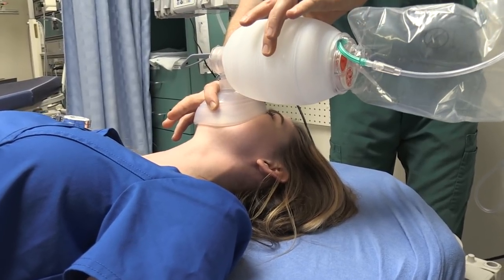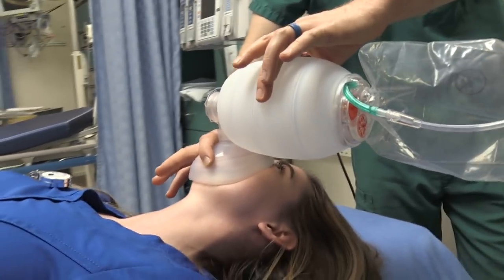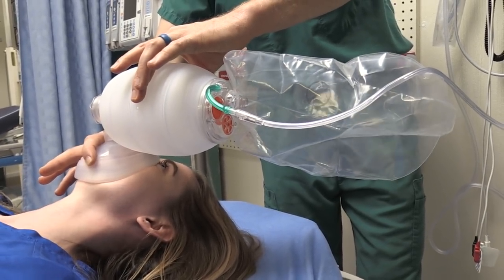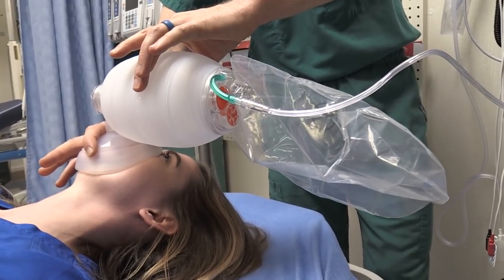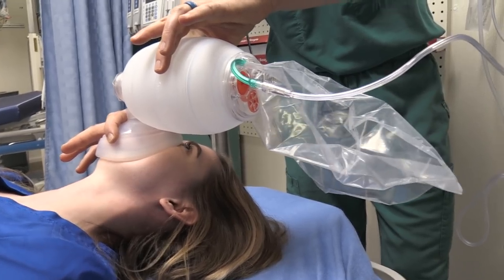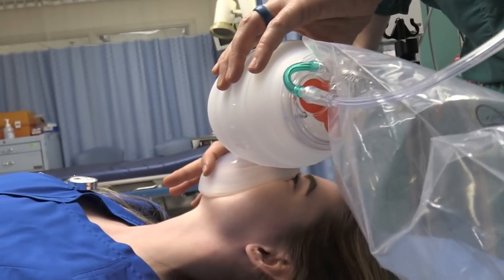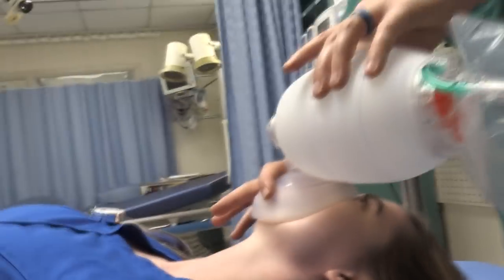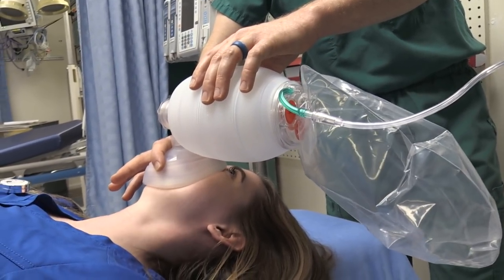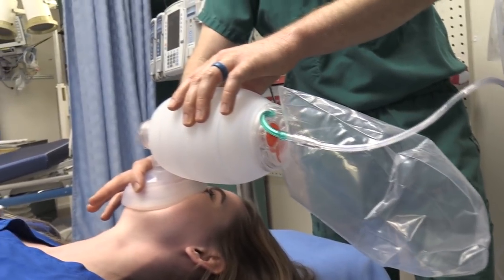You okay? Okay, now what I want you to do, Emily, we're not going to bag, but I want you to breathe in and out, hyperventilate. So if you have a patient who's really working hard to breathe, now she's actually starting to collapse that bag a little bit, which is kind of an interesting thing. Because the question is, can you sometimes overwhelm your bag? Okay, I'm going to crank it all the way up now. Now see if you can make that bag collapse. No, the bag didn't collapse. Good, that's enough.